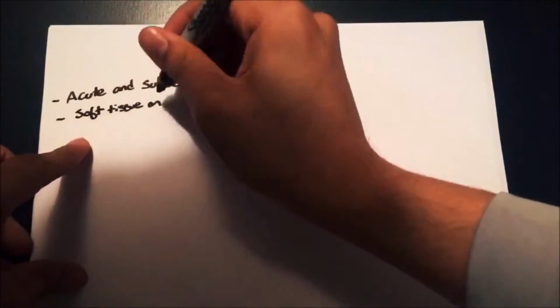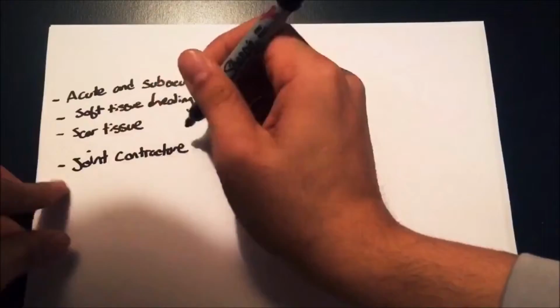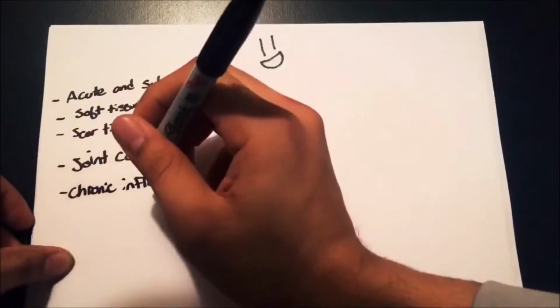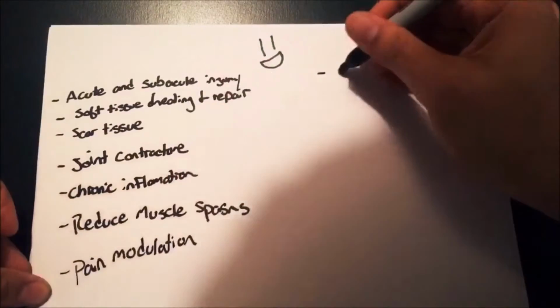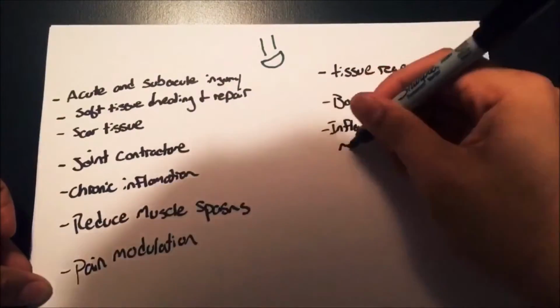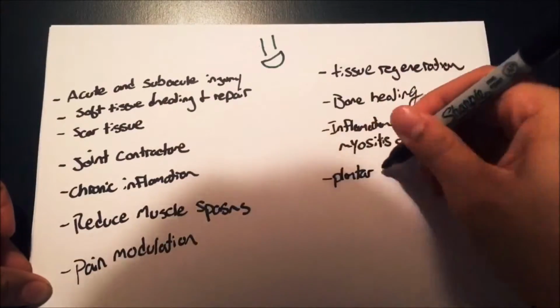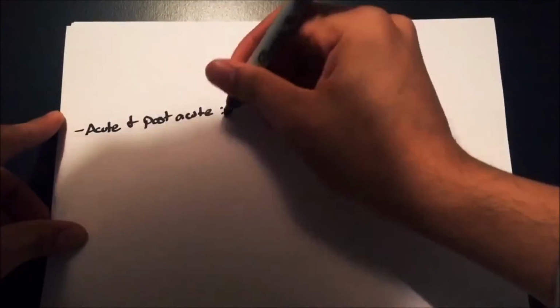Indications to use ultrasound include the following. At any time, you may pause the video if you'd like to take a second to write these down. Contraindications against include the following.